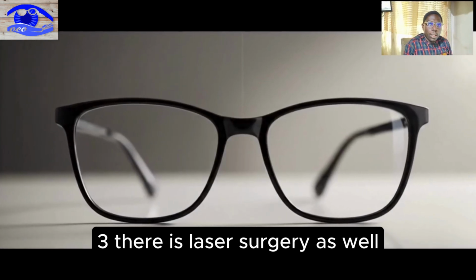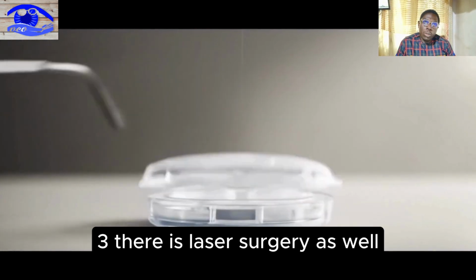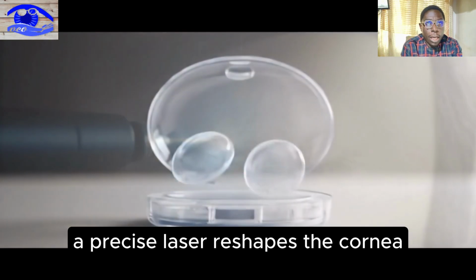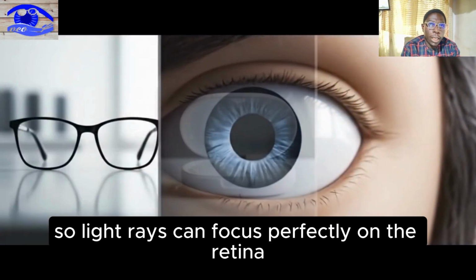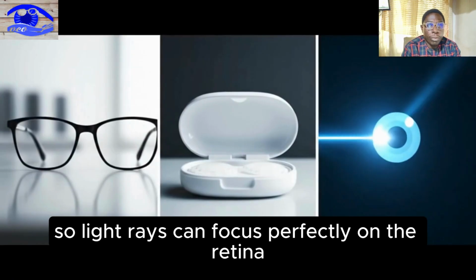Three, there is laser surgery as well. A precise laser reshapes the cornea so light rays can focus perfectly on the retina.